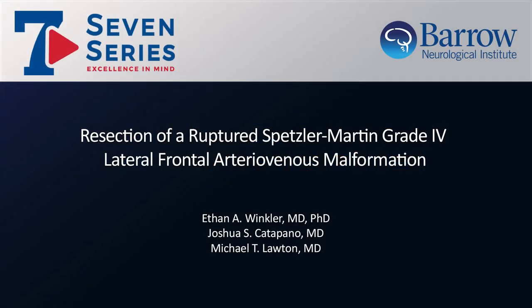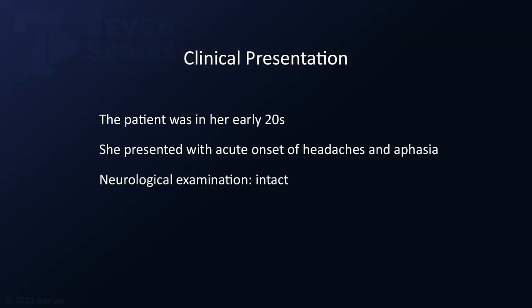This video will demonstrate the resection of a ruptured Spetzler-Martin grade 4 lateral frontal arteriovenous malformation. The patient was in her early 20s. She was traveling overseas when she developed an acute onset of headache and aphasia. She was found to have an intracerebral hematoma on CT scan. An underlying AVM was identified, and she was later referred to us two weeks after her ictus. On presentation here, she was intact.